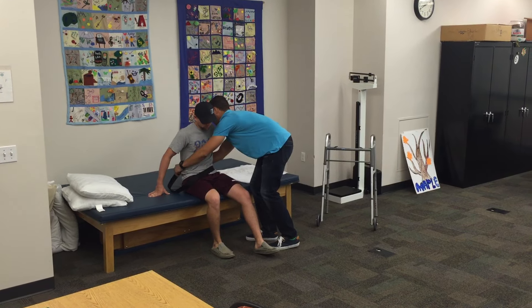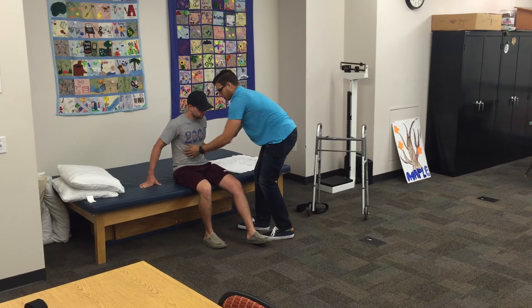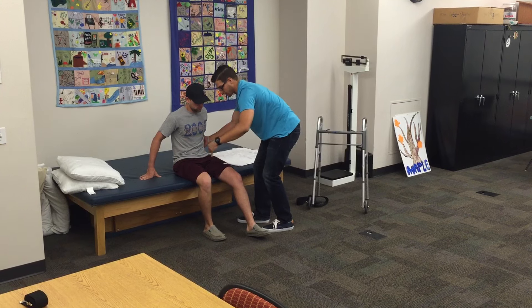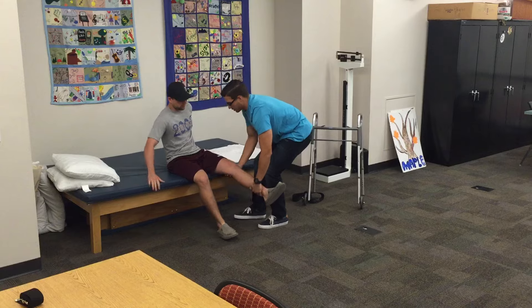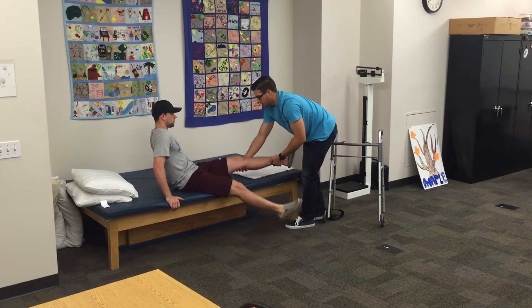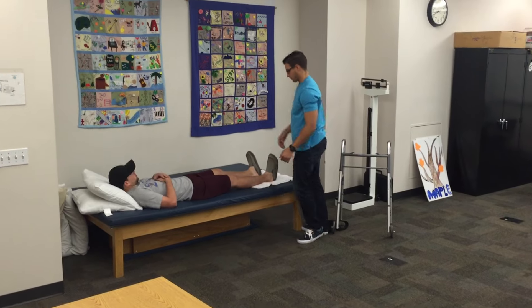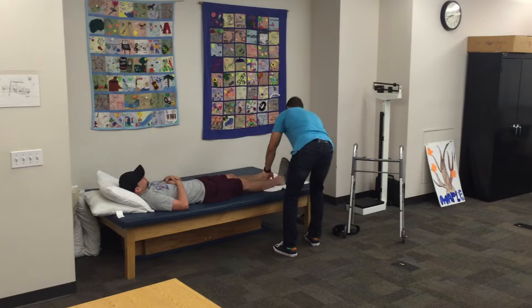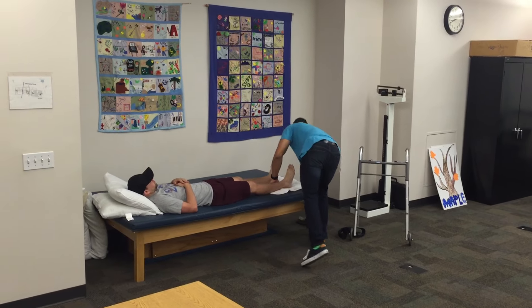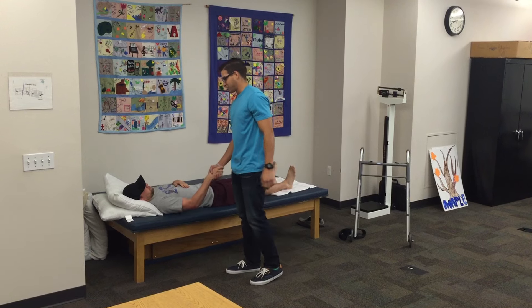So the exact opposite — remember how we left the leg behind last time when we were coming off? This time we're going to lead with it. Same thing — we're going to shimmy back into supine. Good. Put it down there. How are you feeling so far? Good. Okay. All right, great job. Got anything else I can get you? No? All right, have a great day. Thanks.